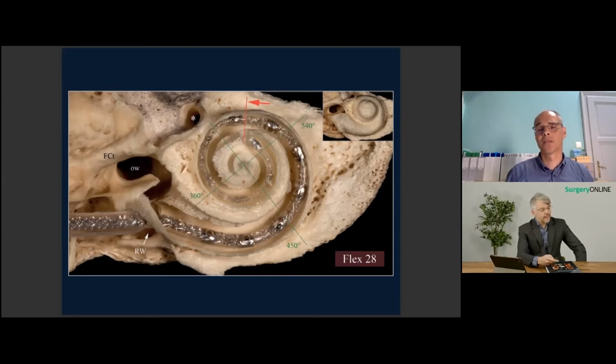You can regulate just in this first 4, 6 electrodes. The other parts of the electrode will follow just the anatomy of the cochlea. But it is so important to put it in the real position. This is the apex of the cochlea. If you don't open this area, the electrode will come first laterally and after that medially. And this is not optimal.